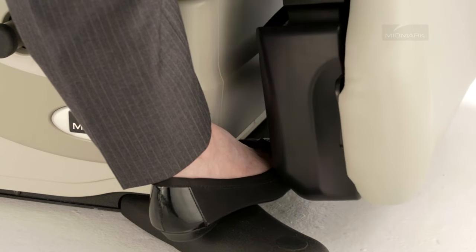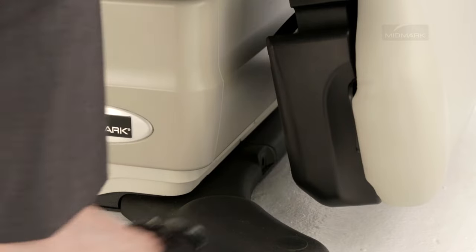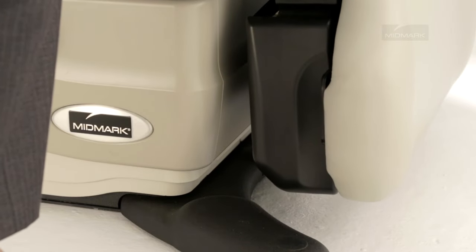To resume the foot section operation, push the treatment pan all the way in, remove the object from under the foot section, check if the foot extension is extended, then press the foot up or down button.